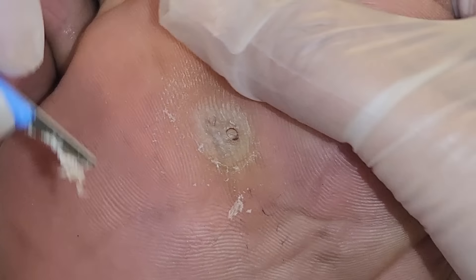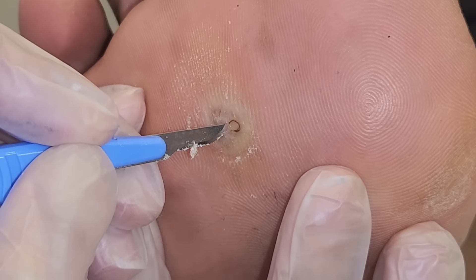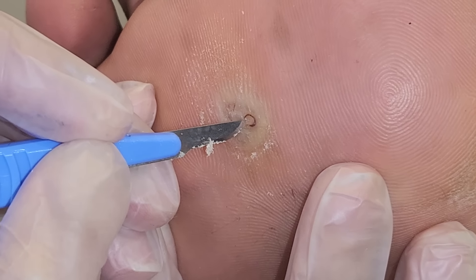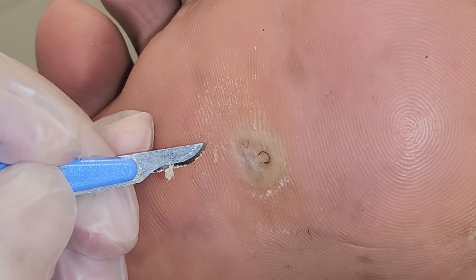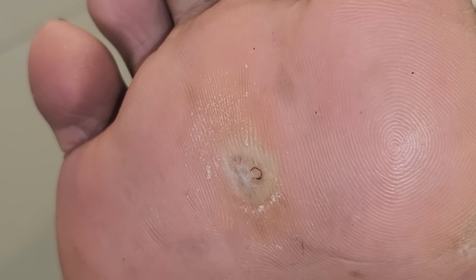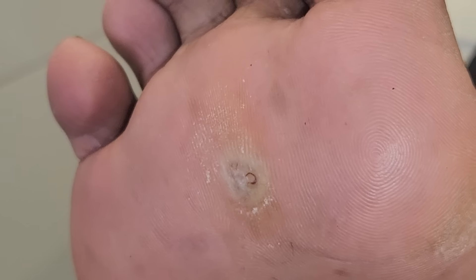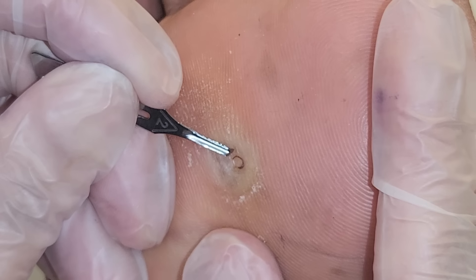Oh, it looks painful. Two different kinds of lesions here. We've got this that resembles a little bit of a corn, but also we can see the little tiny compressed blood vessels and these bits of the verruca. So you could have a combination of both. What I'm going to do is just scoop it out with my number two blade.